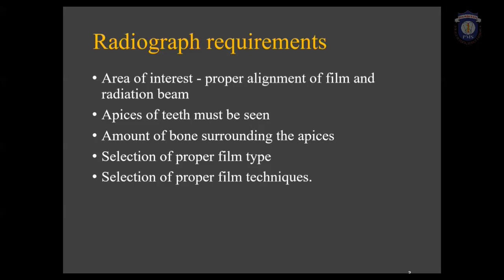Prior to taking the radiograph, we must ensure that the proper selection of the film type has been done. The proper selection of the film technique to take the radiograph has also been decided beforehand.